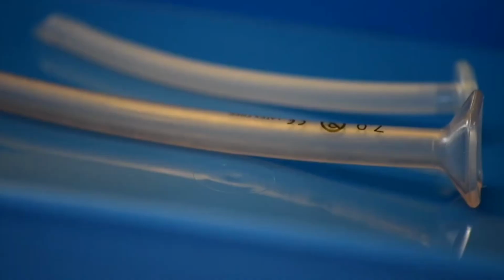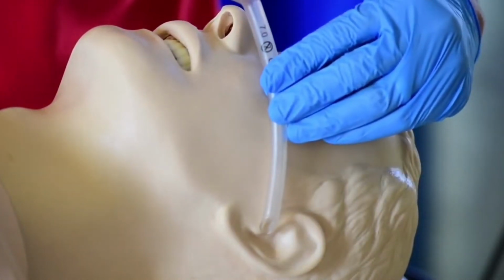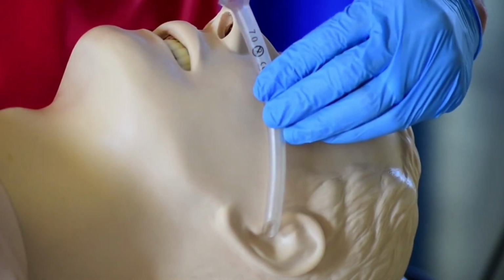Sizes 6 and 7 are suitable for most adult patients. Sizing the device can be performed by a simple visual assessment, selecting the largest NP airway that will fit the patient's nostril without blanching the capillary bed. Measuring the device against the side of the patient's face, using the distance between the tip of the nose and the tragus of the ear, also gives an indication of the correct size to be used.